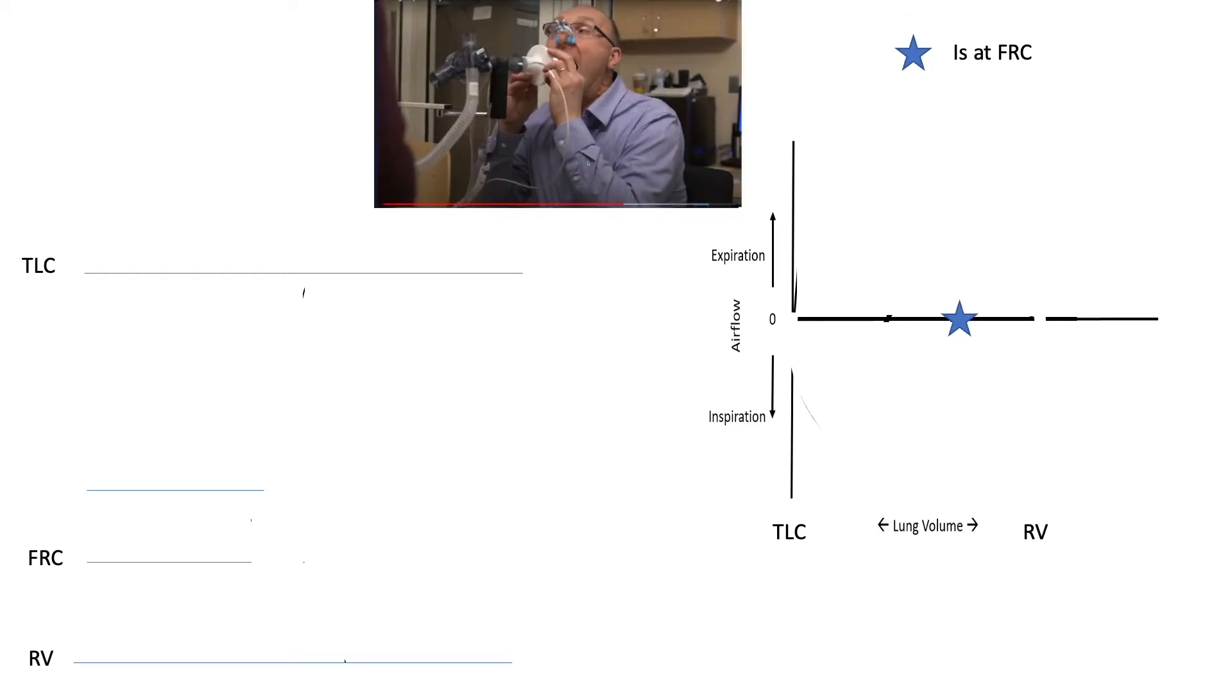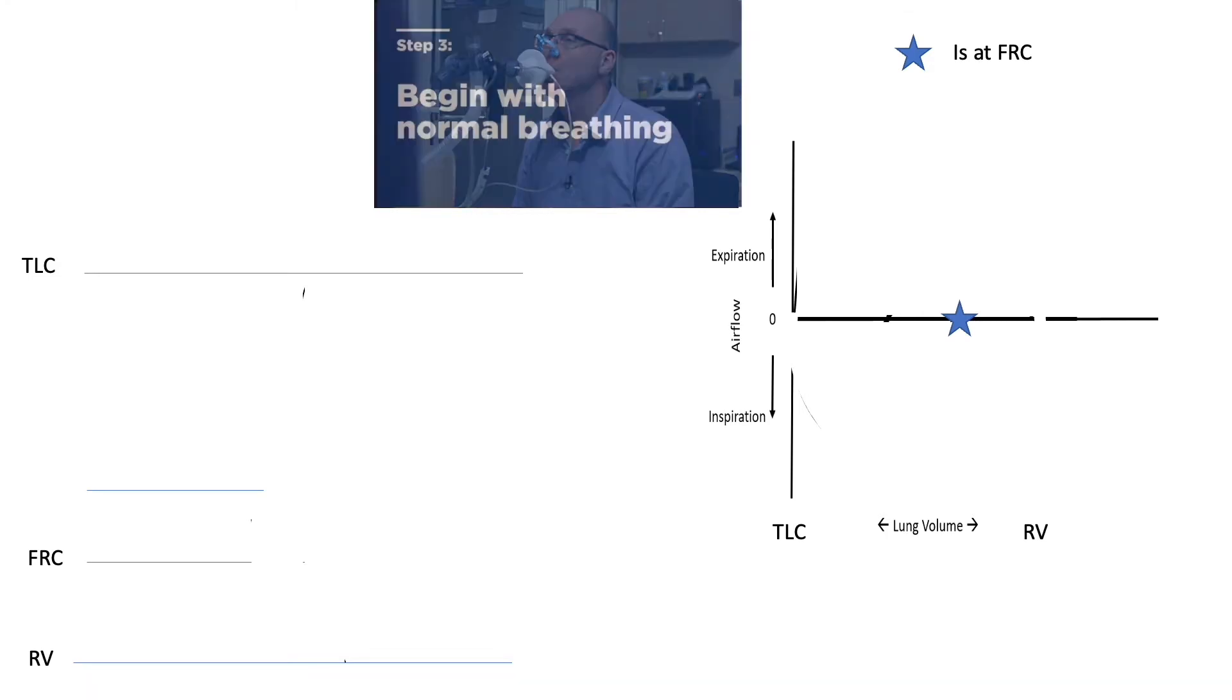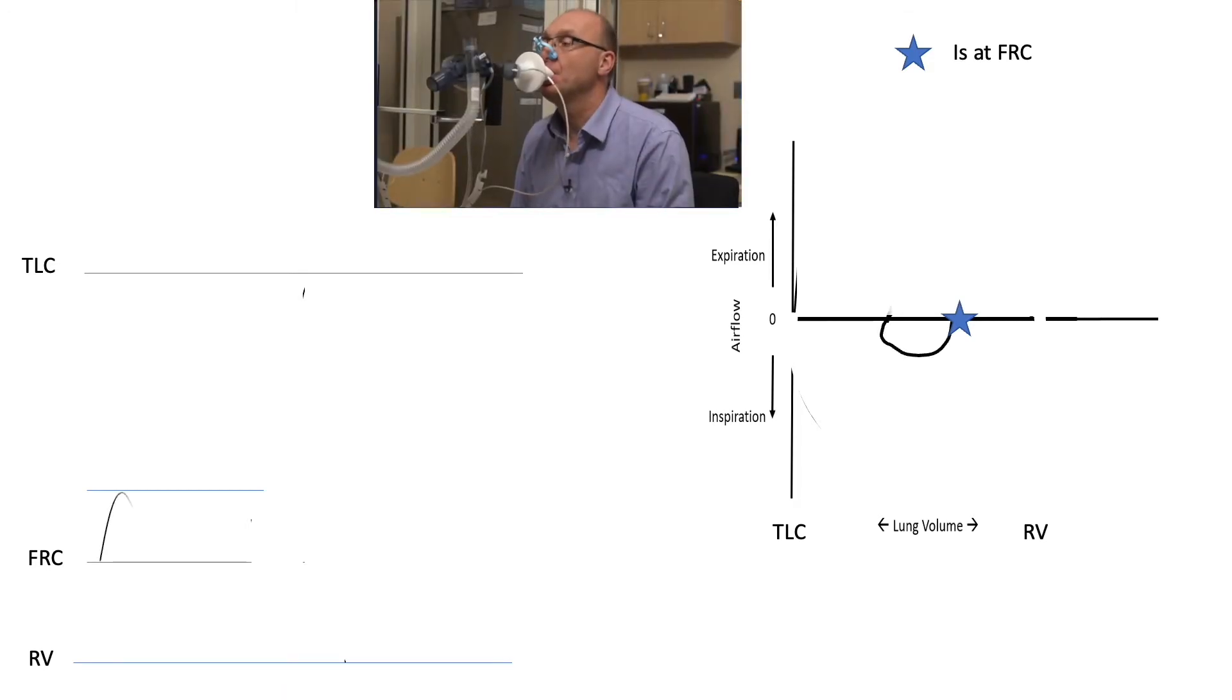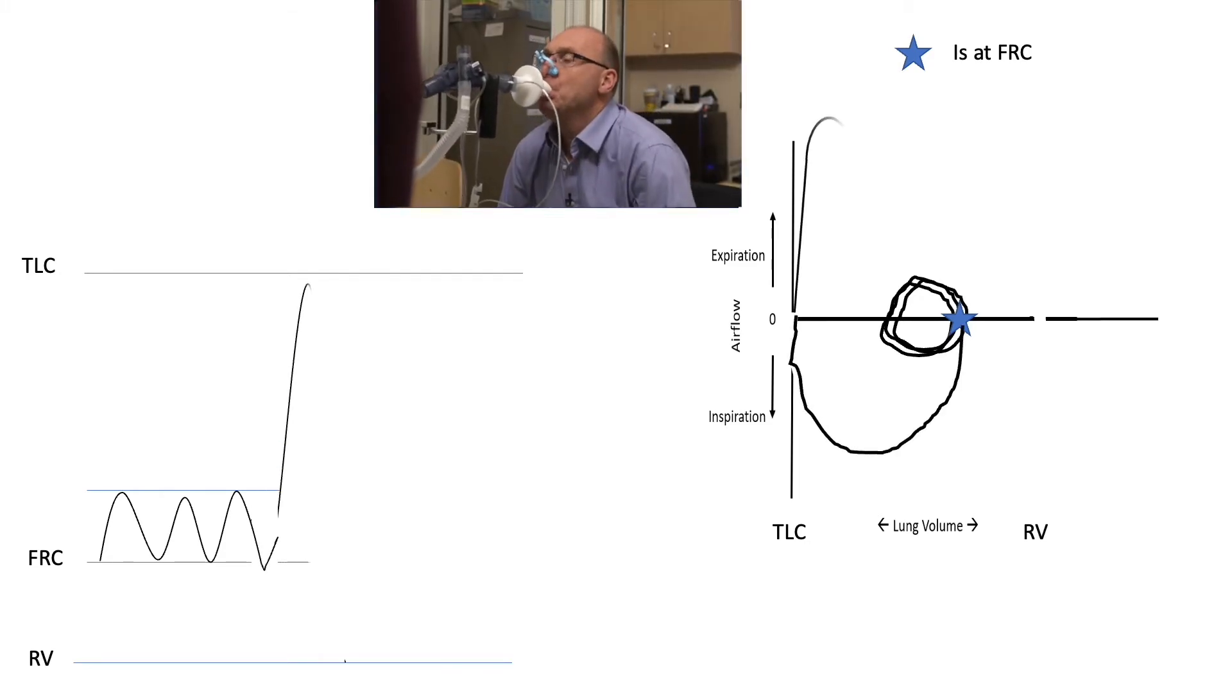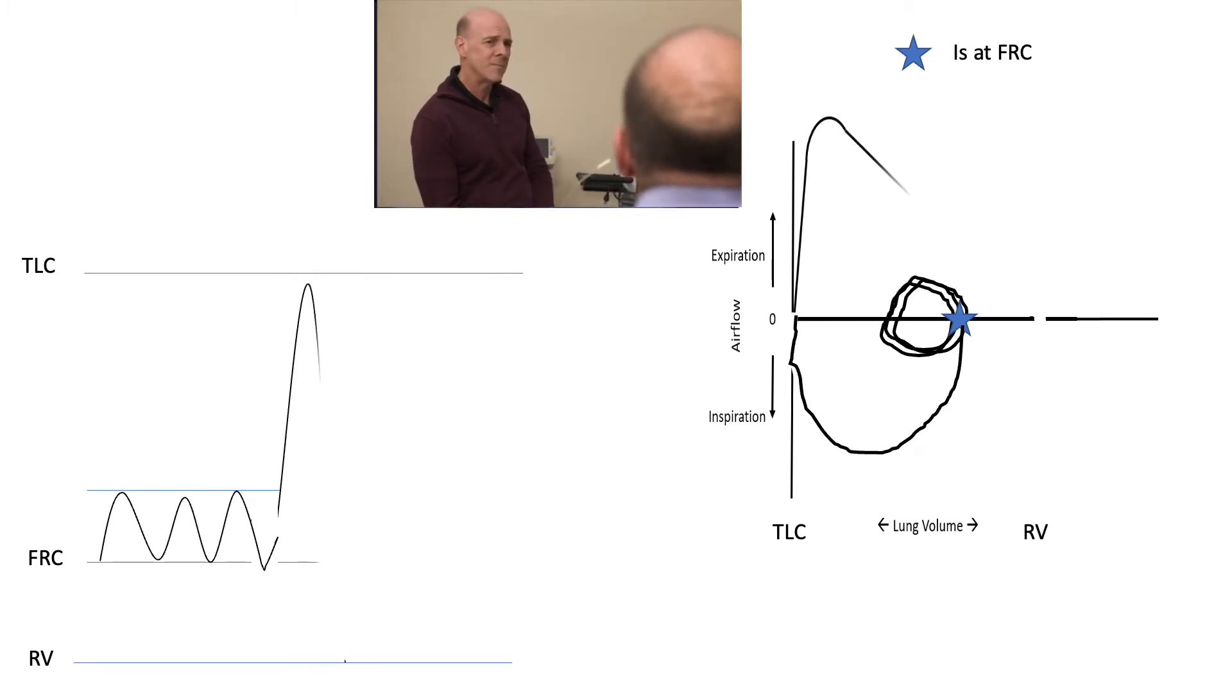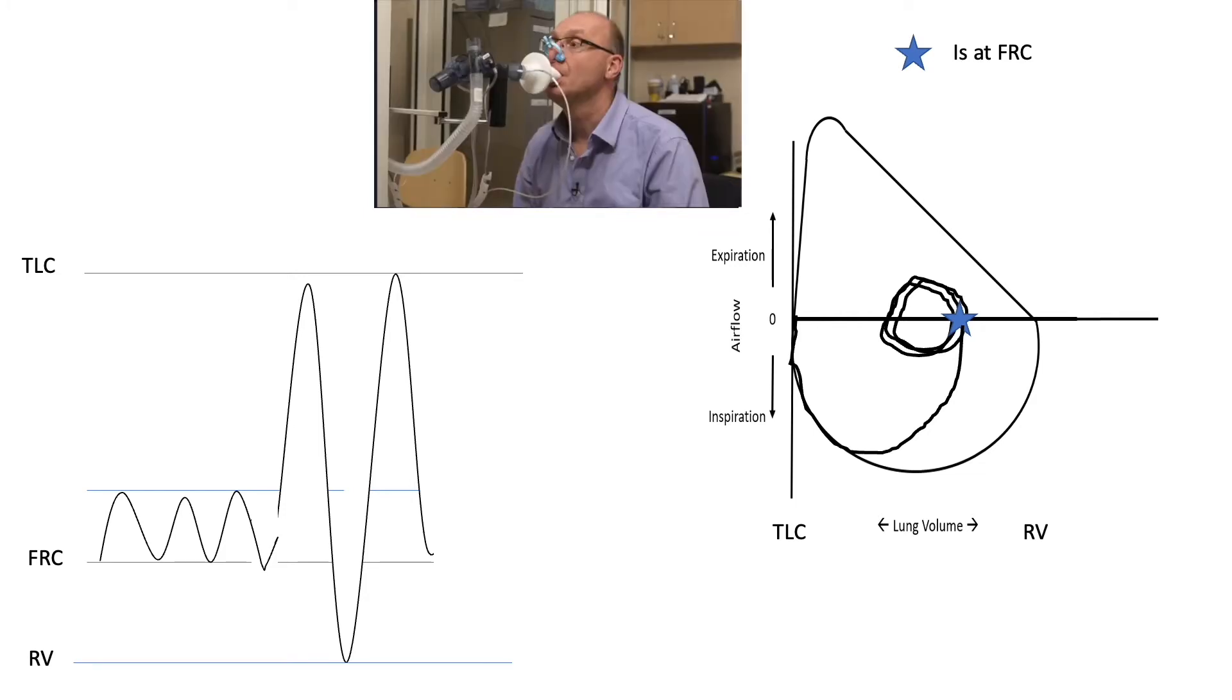I need your lips over the outside portion. Have your teeth go behind it. Teeth bite down with two tabs. Just want to be sure your tongue is not occluding the hole in the mouthpiece, and just want you to begin with some normal breathing. Alright, and now take a fast deep breath in and blast it out. Keep blowing, keep going, you're doing great, keep pushing out, and take a fast deep breath all the way back in. That's great, you can come off that mouthpiece.